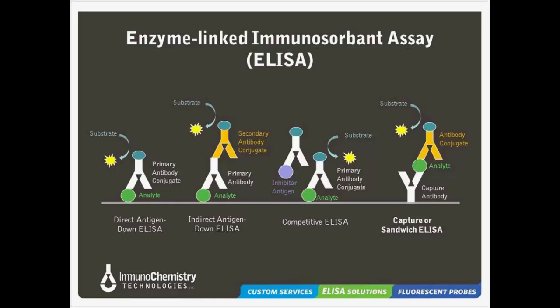So there's an extra layer here on this one on the far right, and the third antibody would be anti, say, mouse isotype to whatever the other side top antibody for the sandwich antibody is. So it's actually a 3-layer thing. It's a lot harder to do because you've got 3 layers instead of just 2. So trying to develop and optimize an assay like this is a lot more difficult than just having a top antibody that's directly conjugated with your enzyme signal generator.